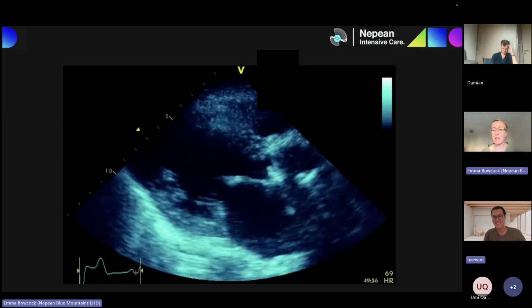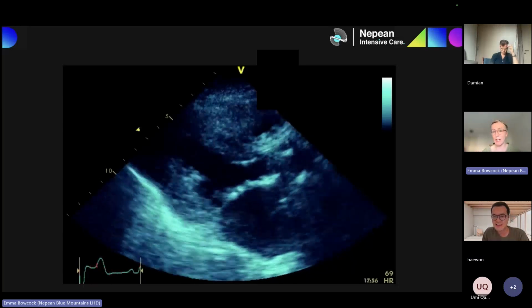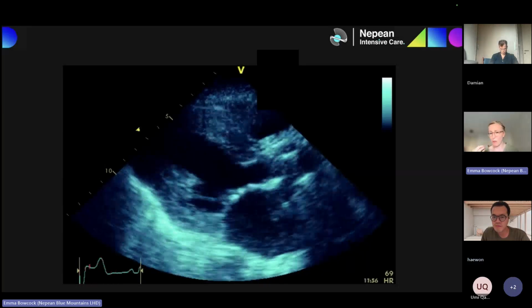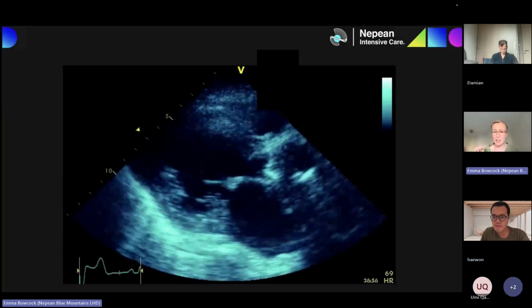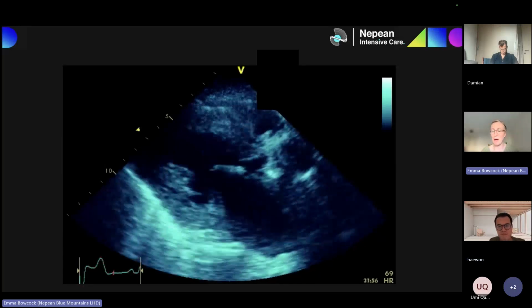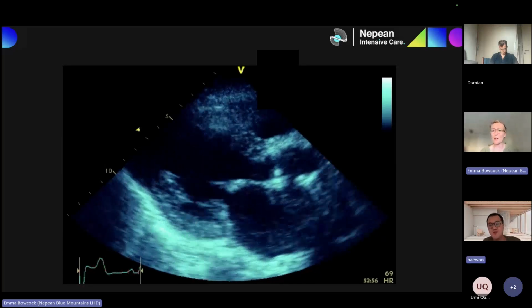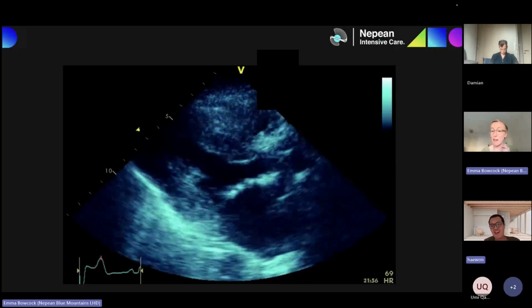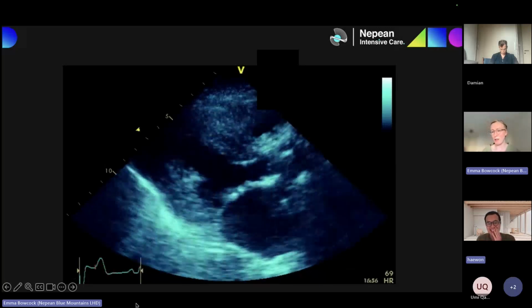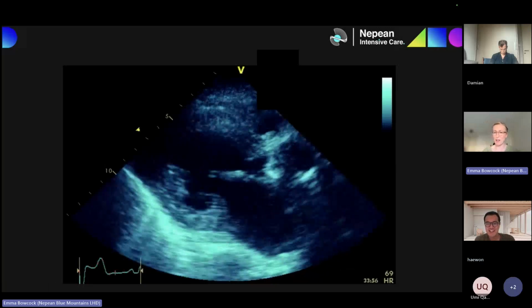It's fine in the viva because you're not going to have a really long time. You obviously need to have some system, but if you see a rip-roaring abnormality, you need to go straight to it. Otherwise the examiner is thinking, tell me about the aortic valve, which is what I was doing while you were telling me about the RV. I don't really care about the RV too much here. Just tell me what the aortic valve is doing.